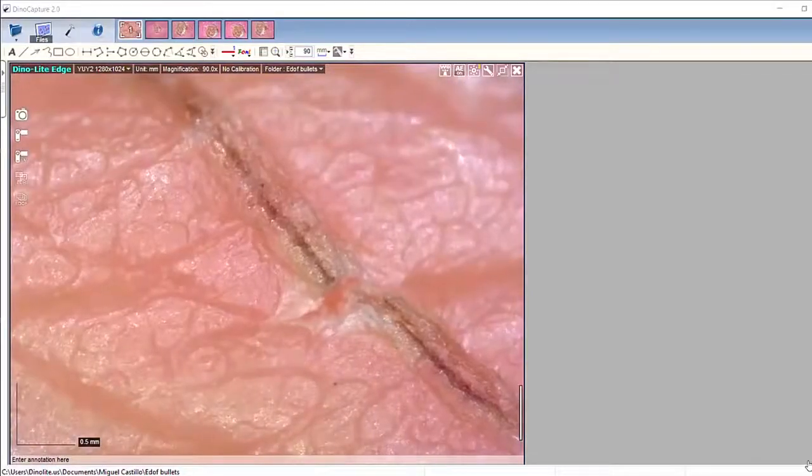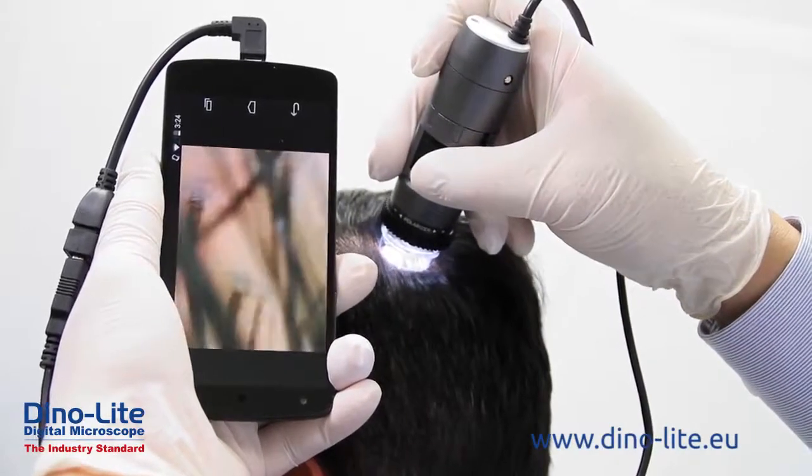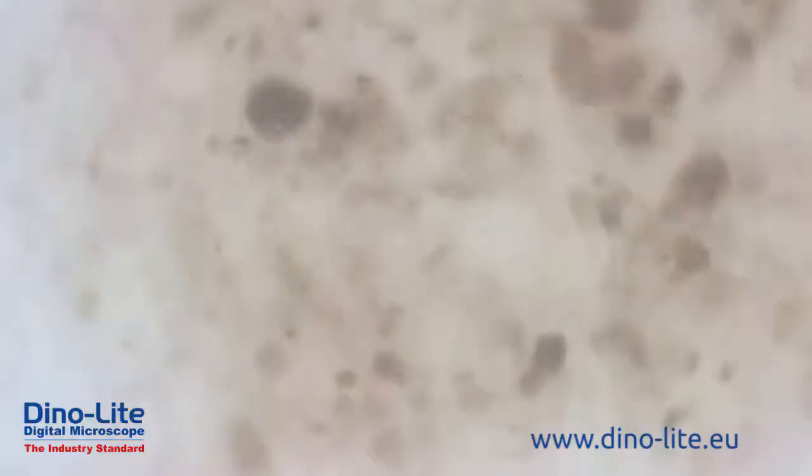Dino-Lite digital microscopes are easy to use, include feature-rich software, high-quality imaging, all in a compact portable design. Combined with various budget-friendly models and a large selection of accessories, Dino-Lite microscopes are the obvious choice for users in any application.